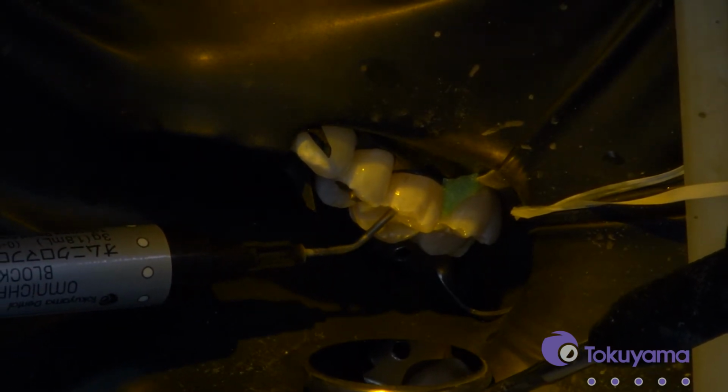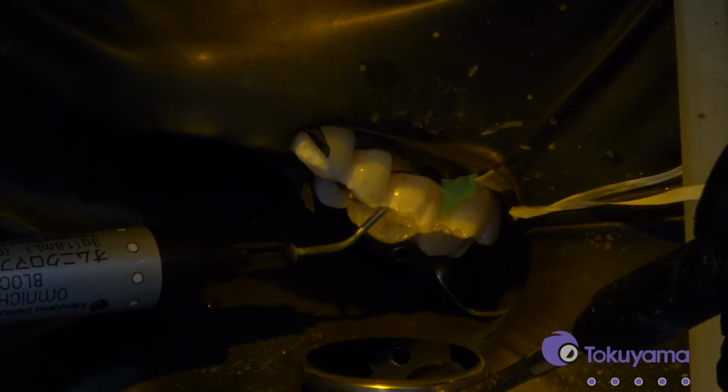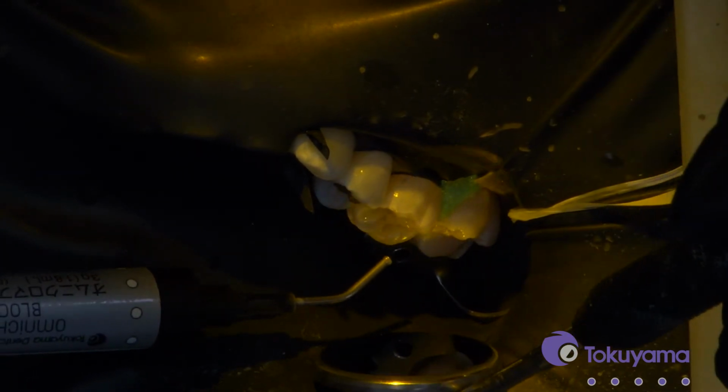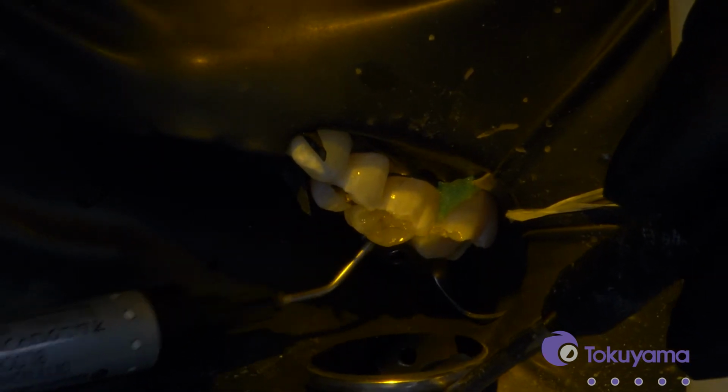Now, if you overdo it with the blocker, what you'll find is you probably will have a restoration that lacks chroma, and your value might be a little high. But on a posterior tooth, probably not the end of the world, but obviously we're trying to get our restoration as close to natural as we can. Okay. And OMNICHROMA Flow, thank you.